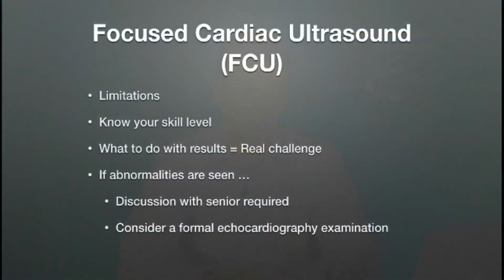So, as I said, there are some significant limitations with focused cardiac ultrasound. When you start off doing these studies, you are going to overcall things, and you are also going to miss things completely. In the same way as if you are looking at a chest X-ray or a CT, you've got to know your limitations. You've got to know at what stage you are on that spectrum of training between someone who's a complete novice to someone who is an absolute expert, and the accuracy of the conclusions you're drawing.